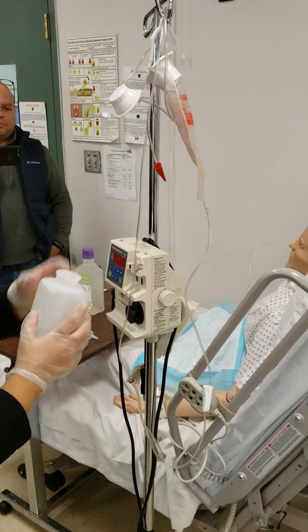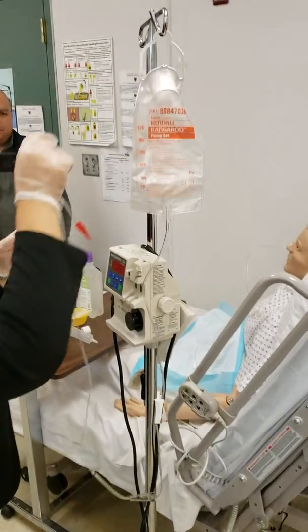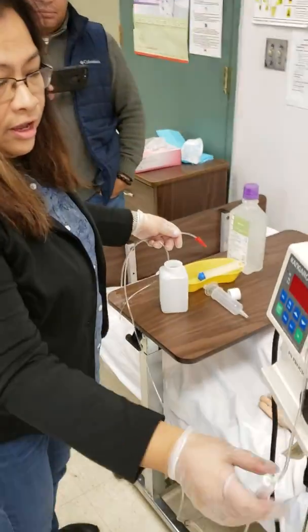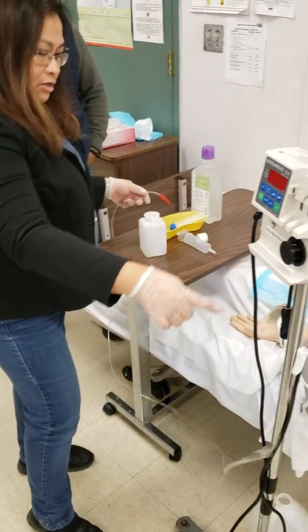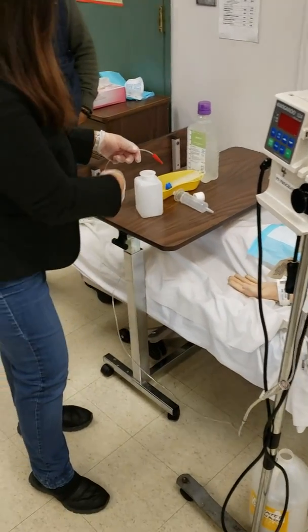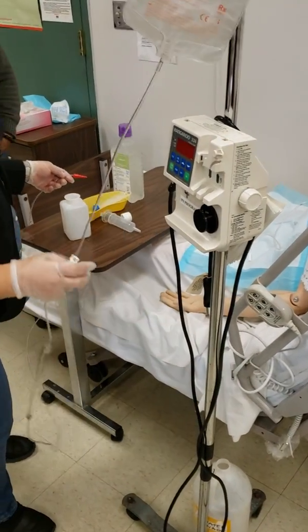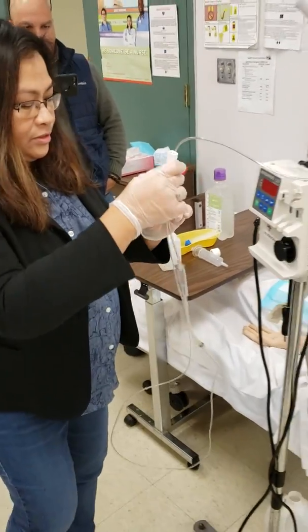And then you will prime it. It's almost like an IV piggyback. Right, you can use the MSC and prime it, all right? So you will allow that fluid to go through there and here and there. And when it starts leaking, you close it, all right? Then we will go and put this over here.